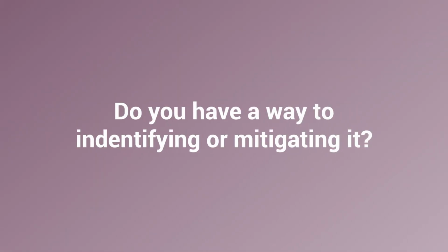It just happens that one indication is stained with protocol A and another indication is stained with protocol B, or at site A and site B. And then if you're using deep learning or any sort of machine learning to generate insights from this data, you might find things which are more related to the batch effect rather than to the biological effect. Yeah, and this is a big issue in the industry, where you don't always have all the information that can cognitively help you identify this bias. Do you have a way of identifying it or mitigating it?